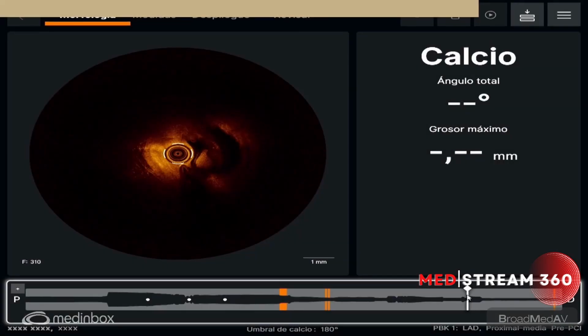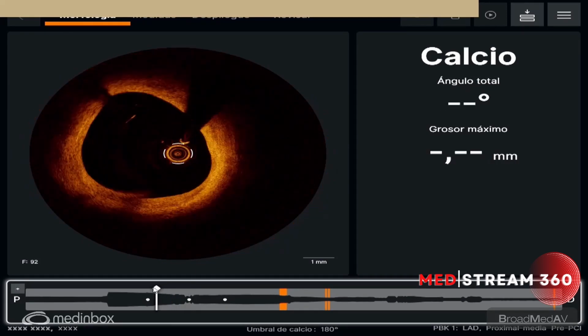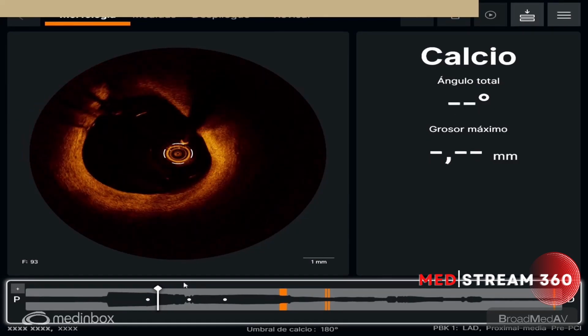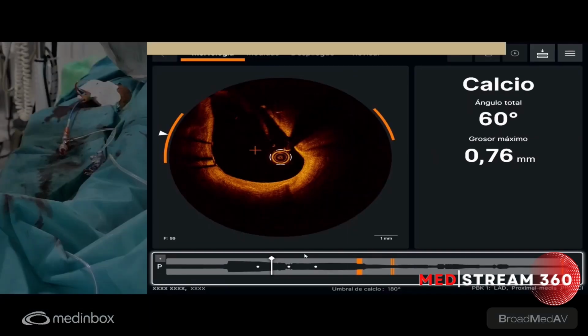The stent is not protruding so much. The distal vessel. And the other thing we can do, as I have put some nitroglycerin, because the other thing was the bridging that was at the distal part of the vessel, you see. This is another point to debate in this case. Probably it's better to leave it alone with medical treatment because of the probability of stent fracture, stenosis, and only if the patient suffers from angina related to this lesion, we can address it.